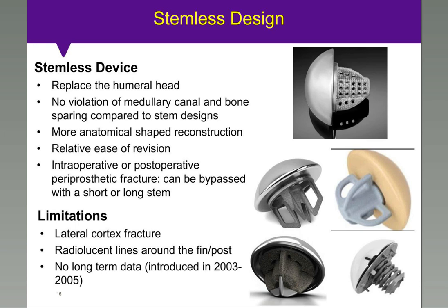However, there are certain disadvantages associated with the stemless design. There's a risk of lateral cortex fracture. Radiolucent lines have been reported around the fins of the stemless design, and we still don't have long-term follow-up data on stemless designs.